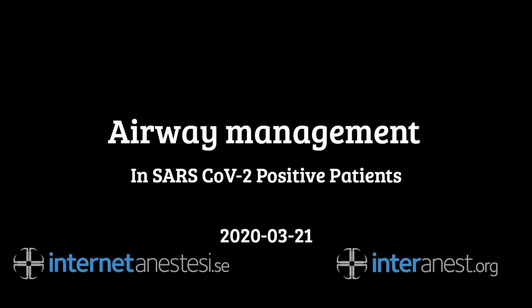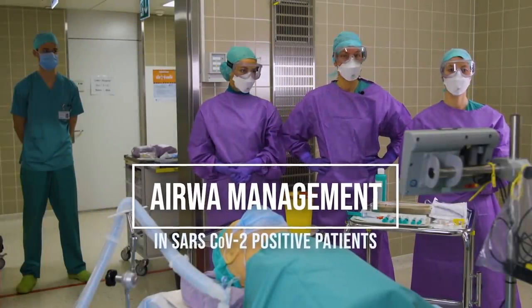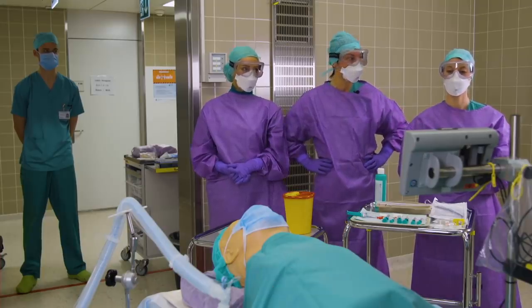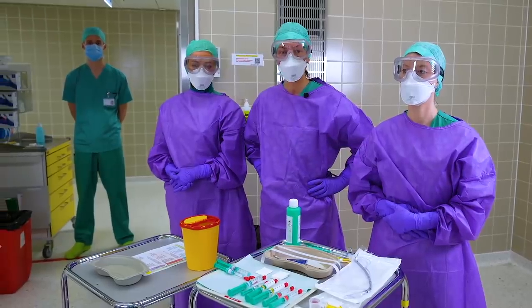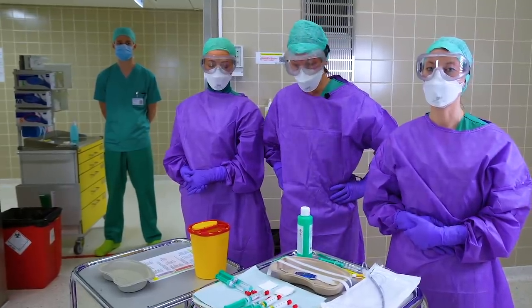This video is a demonstration of techniques that can be used to intubate patients with a suspected COVID-19 infection. It's been produced by Dr. Lukas Kandler, who is a consultant anesthesiologist in Zurich. We are from the Institute of Anesthesiology at the University of Zurich. My name is Vanessa Moll. I'm an attending here. Larissa is a resident and Manila is an anesthesia assistant. We are here today to introduce our airway management concept for COVID-19 positive patients at our university hospital.